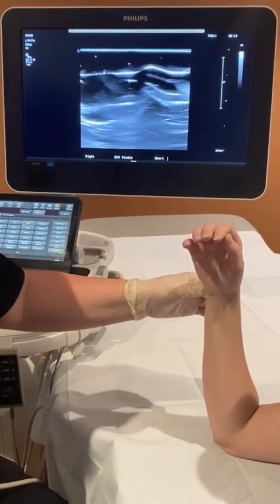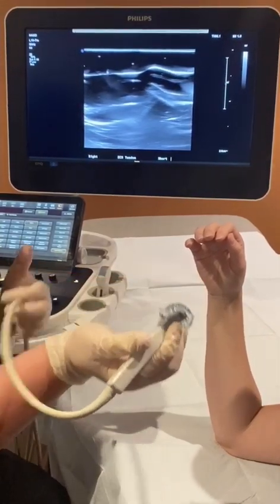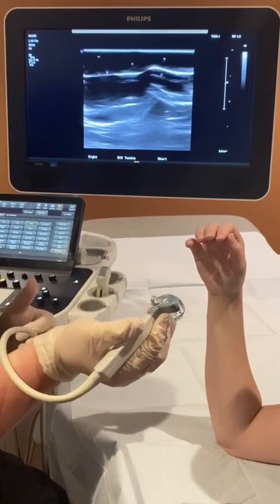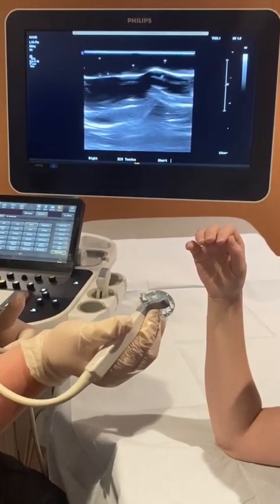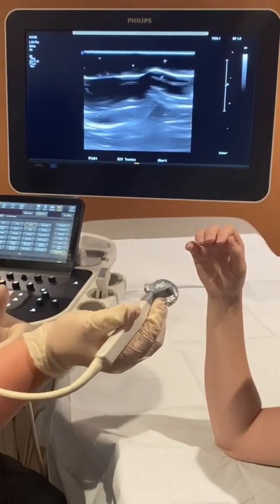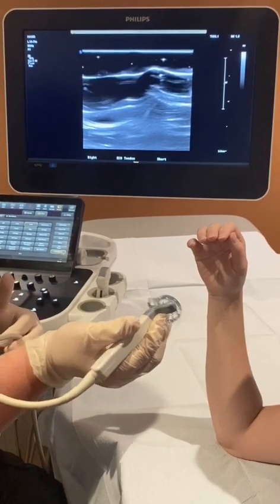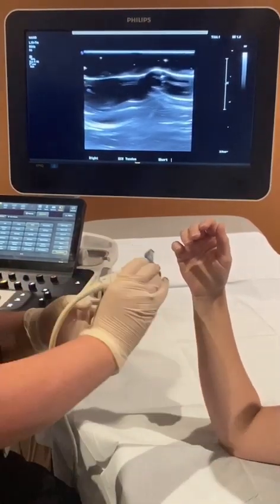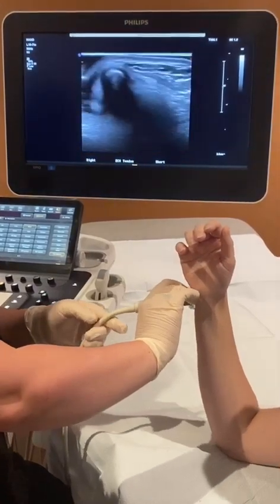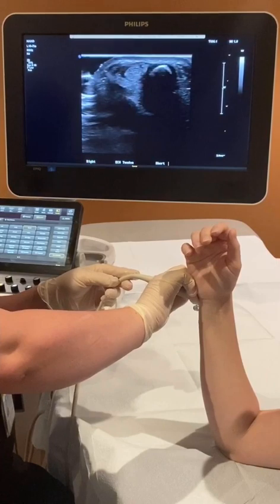What you want to do is use a high-frequency small footprint transducer like your hockey stick. If you don't have a hockey stick in your practice, you can also use a linear high-frequency transducer — this transducer is just easy to maneuver around bony structures. Use a lot of gel so that you can get around the bony structure of the wrist, and place the transducer right on the ulnar side of the wrist over the ECU tendon.